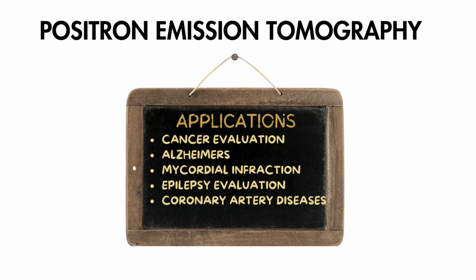PET is majorly used for cancer evaluation, Alzheimer's, myocardial infarction, epilepsy evaluation, and coronary artery diseases. While seeing the applications, we can understand that all of these are related to functional imaging. So a functional image is required to evaluate cancer, Alzheimer's, myocardial infarction, epilepsy, or coronary artery diseases.